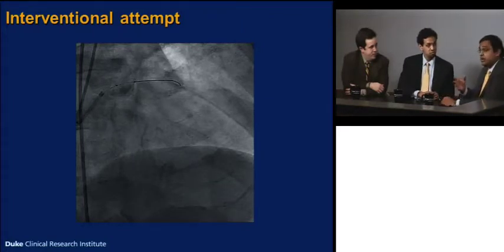So maybe I'll stop you there. I mean, I think at this point, what the team might have been doing, I'm not sure, you can correct me if I'm wrong, but I don't think I was affiliated with this patient, but I think if you're not sure if the LAD is chronically occluded, you may attempt to open it up thinking there's a subacute chronic occlusion, but some in the OAT trial and others would say you shouldn't be considering that unless you know the chronicity of this condition. But the wire sometimes is a way to test it, and they weren't able to open it without going into chronic total occlusion type of care, and maybe that is a good time to stop and say, what is the function? Is it really 45?